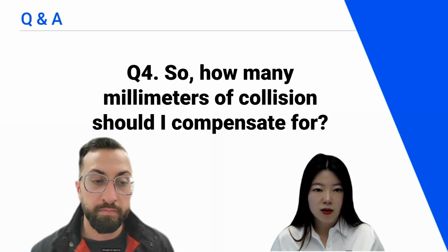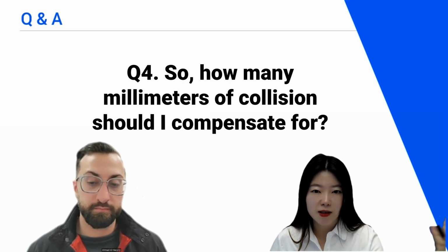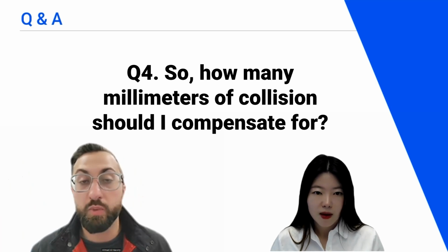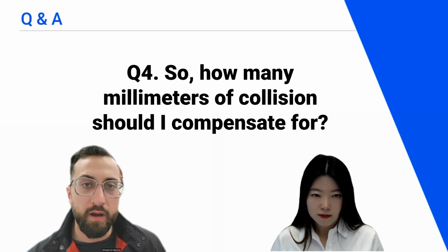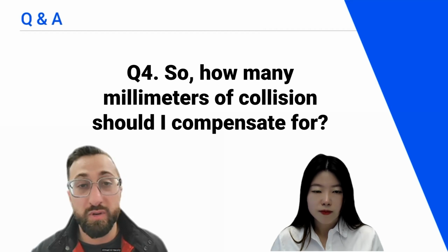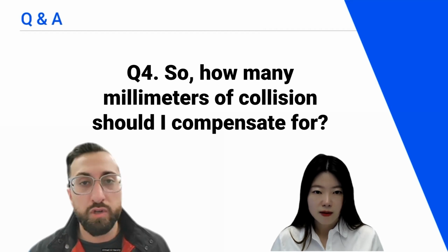Yeah, and also you explained that digital scan data and a real impression are different due to PDL. Yeah, big time. And there's a lot of movement in the PDL, as we all know. So there is that discrepancy that always happens with the scan data. But like I say, as long as you're doing scans on both sides of the jaw and taking full arch scans, you shouldn't have any issues.